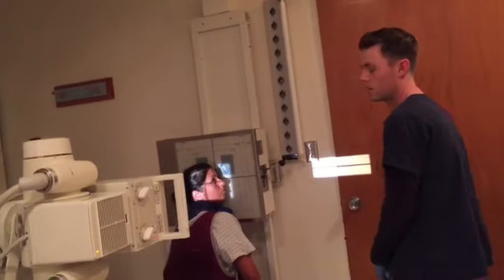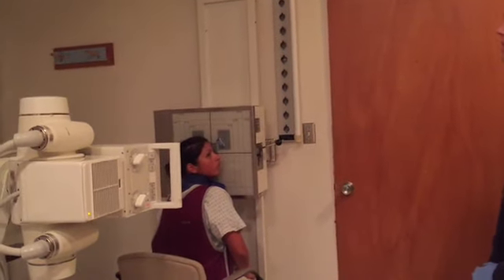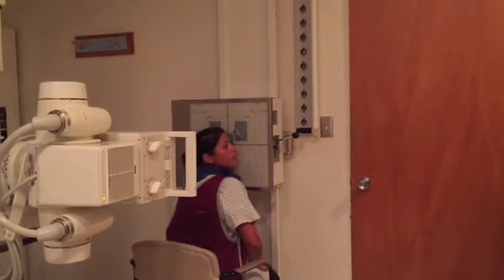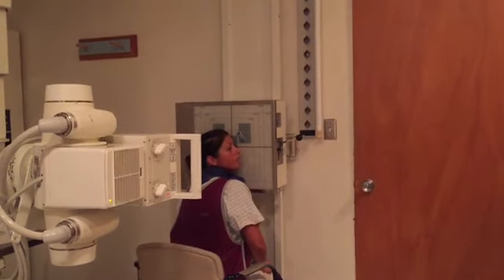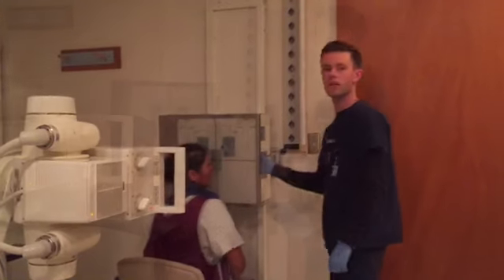About there. For this one, I'm going to keep the same technique, about 75 at 8 to 10 mAs. Alright, Evelyn, go ahead and hold your breath and don't move. Expose. Okay, go ahead and breathe. Move on to the next image.